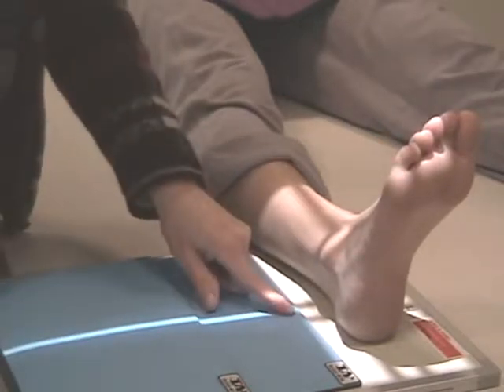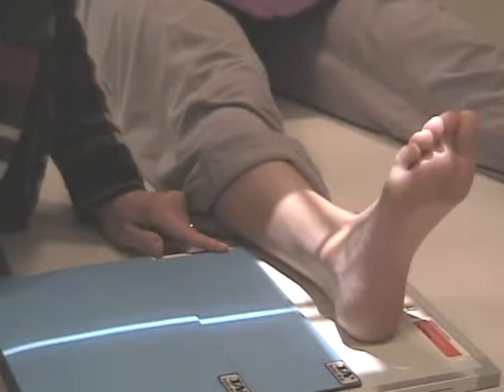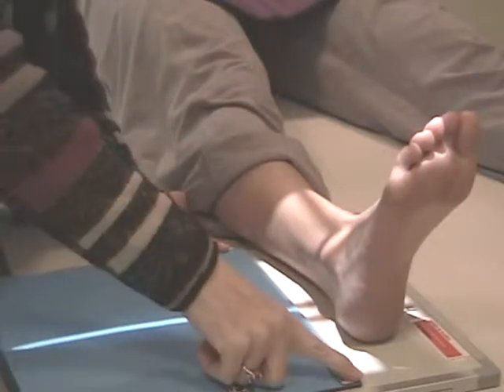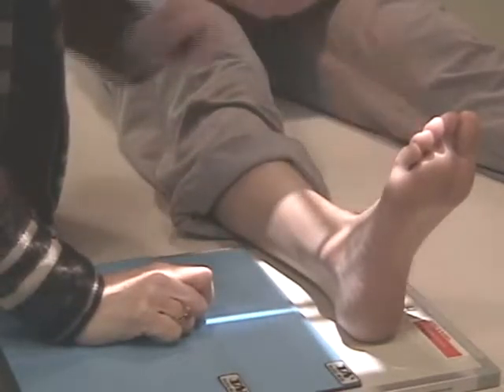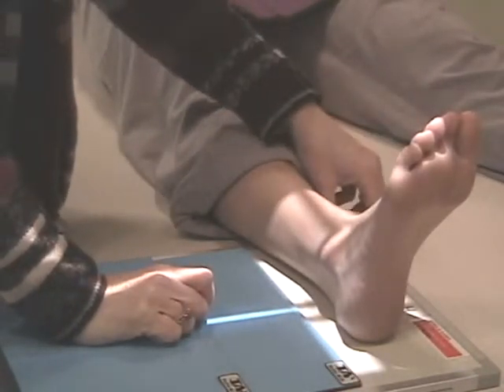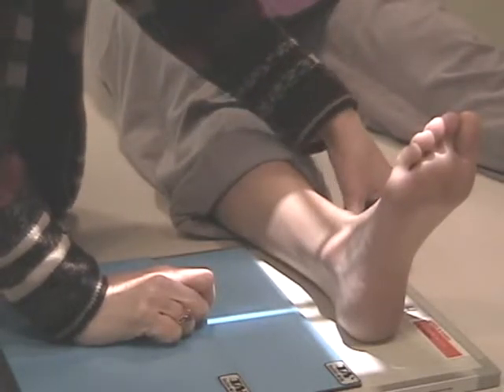And let's show a little bit of collimation. Let's have a little light over our lead strip, and we're going to collimate in and have about an inch of collimation on both ends of the cassette. If this is equal, you know definitely that you've exited to the center of the cassette, and I'm going to make sure this R marker is within the collimated field.